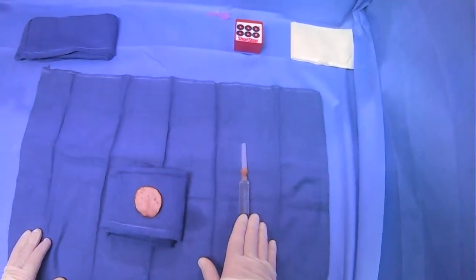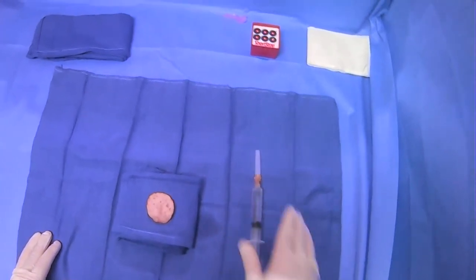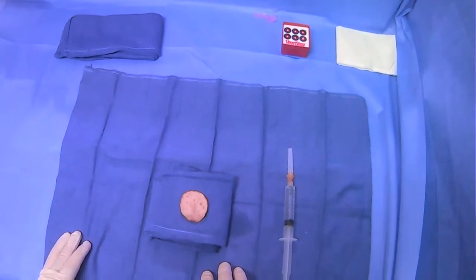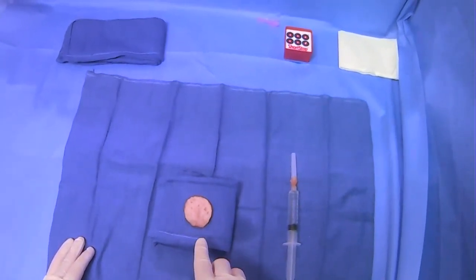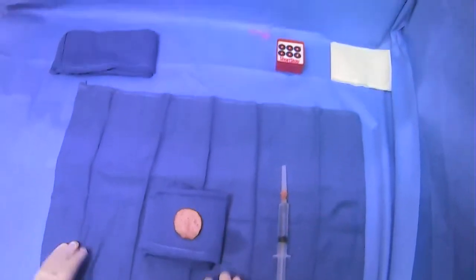So we have our buffered lidocaine here. We have a 25 gauge needle here, and then for the purposes of our demonstration, we're going to be using a piece of dried apple. This probably won't make a wheal as well as real skin, obviously.